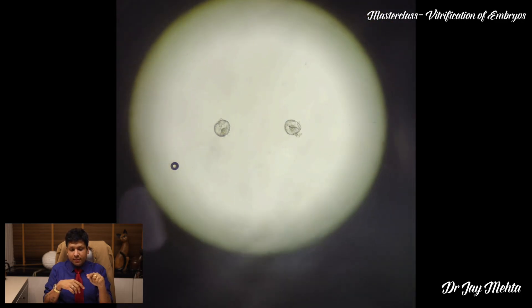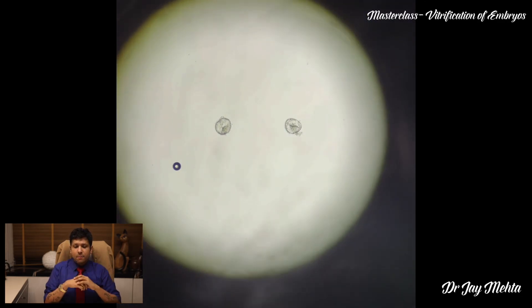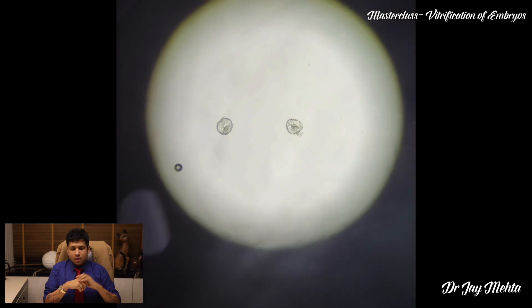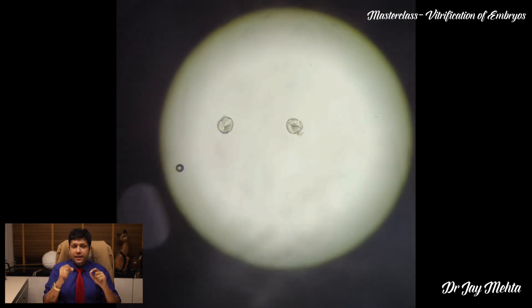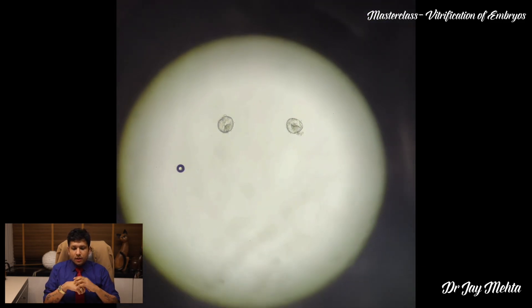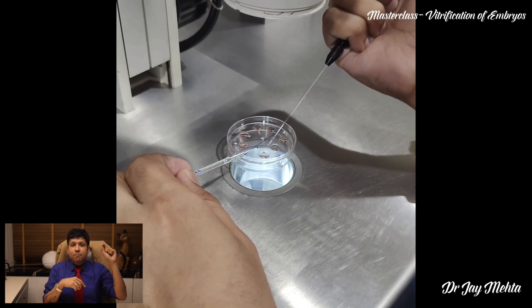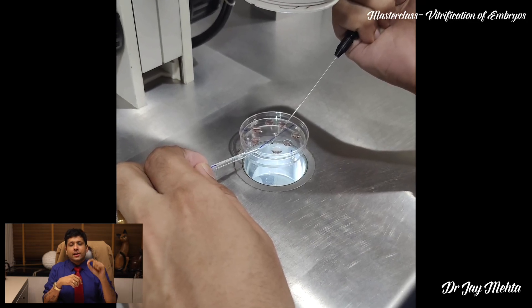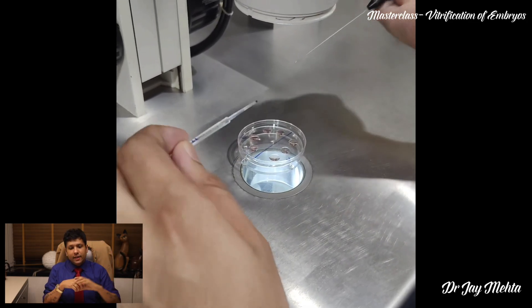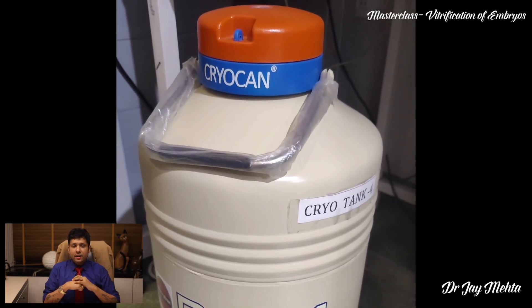You can see these are the embryos in the vitrification solution — they have further shrunken compared to before in the equilibrium solution. Now in the final step, the embryos are going to be picked up from the vitrification solution, loaded on the cryotope, and then immediately plunged in liquid nitrogen within one second. This straw is then located in one of the cryotanks, labeled with patient coding and identification, and further processing information for the embryo is then communicated to the patient.